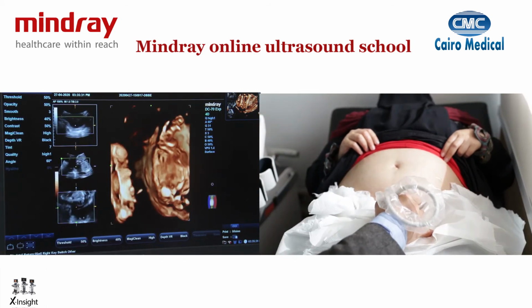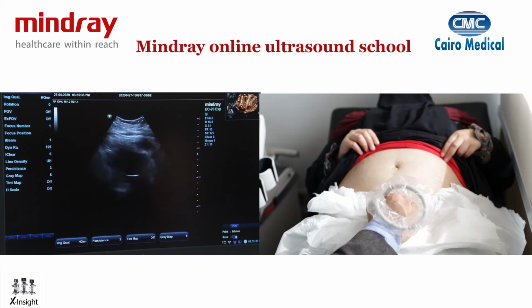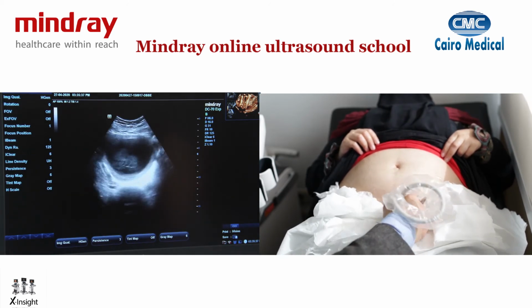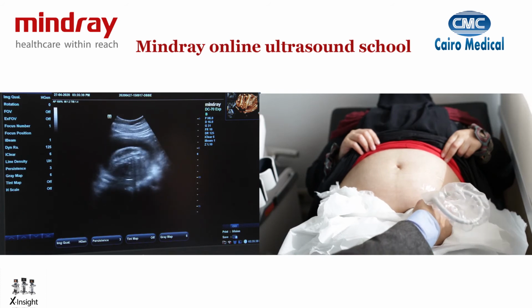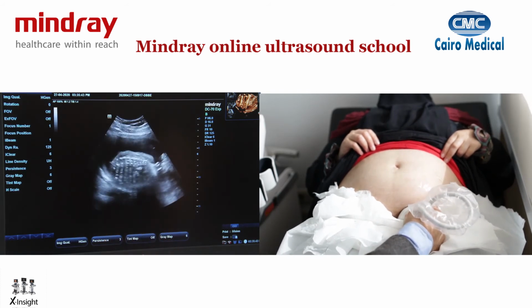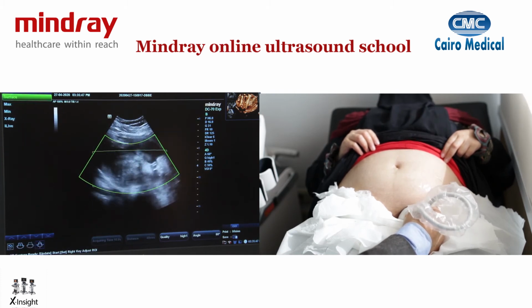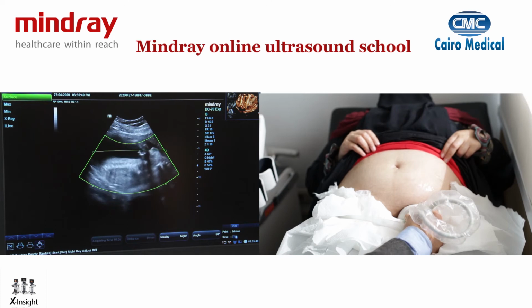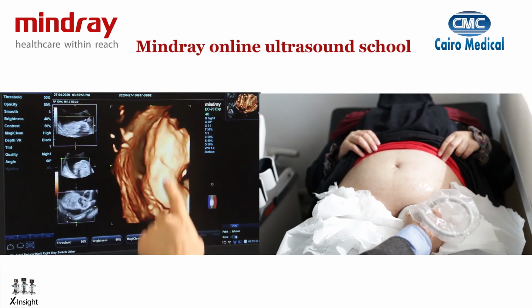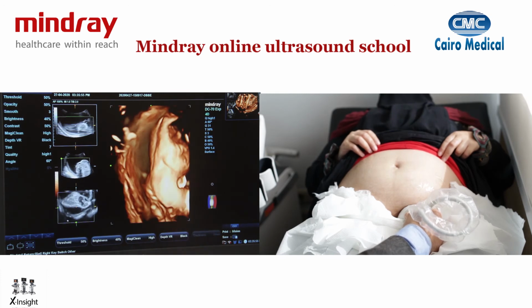So I'm now parallel to the spine. Let me try and get a better grip of it again. Okay, baby's moving. So the baby is helping me now with getting the spine a bit upwards as it was starting to face down. So I can put my real-time 3D parallel to the spine and get a surface image of the spine. You can see a surface image of the back of the baby here.